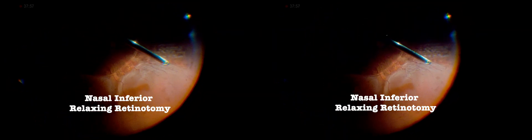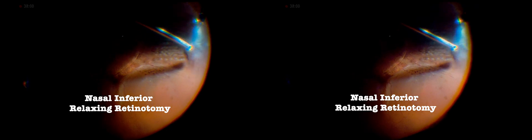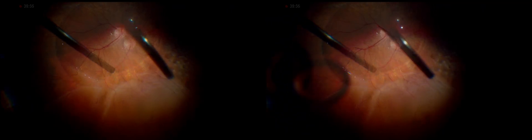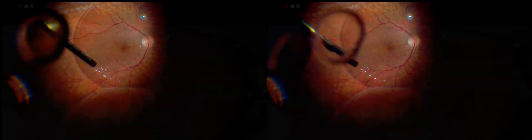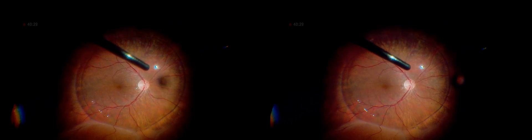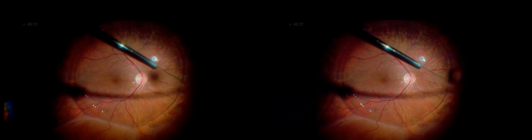A nasal inferior relaxing retinotomy was required to prevent further progression of inferior retinal detachment and PVR. It's always a plus to have crystal clear visualization during the procedure — it makes all the difference for precision.